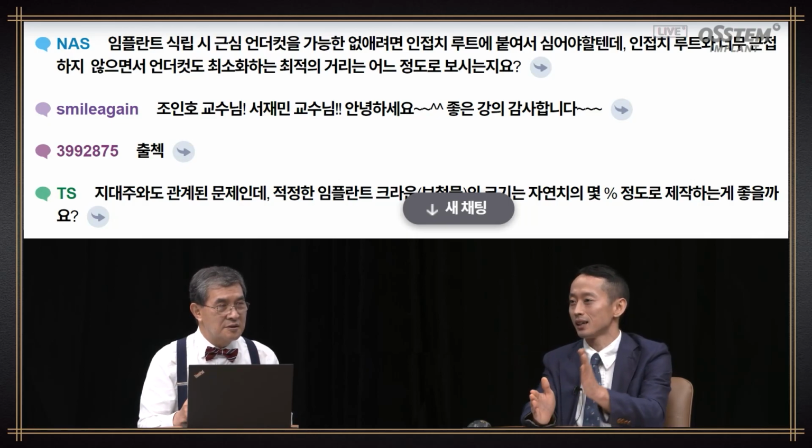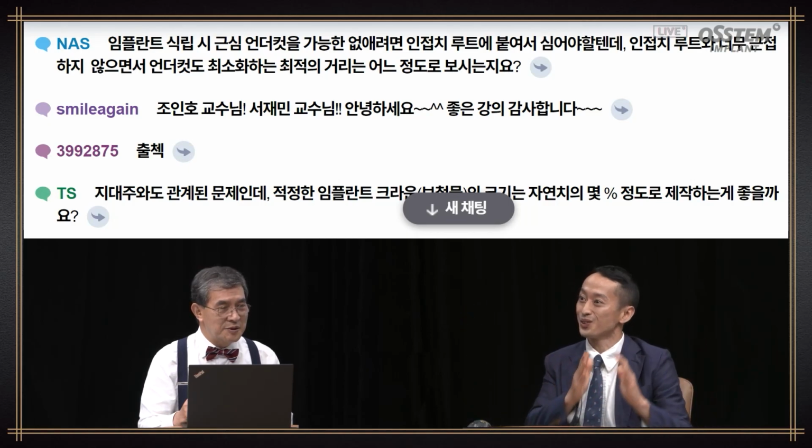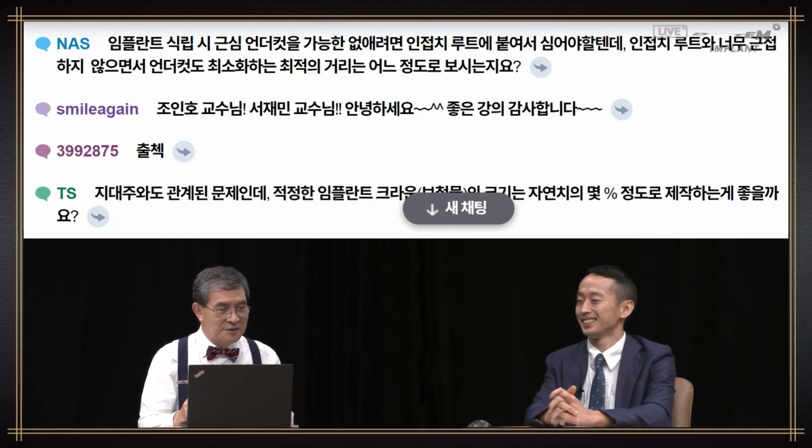If there's teeth mesiodistally, I think it is best to place it in the middle. I'm talking in the sense when we're placing the most distal tooth. When you look at the interns, because it's their first time placing implants, they try to place the implant apart from the adjacent root.